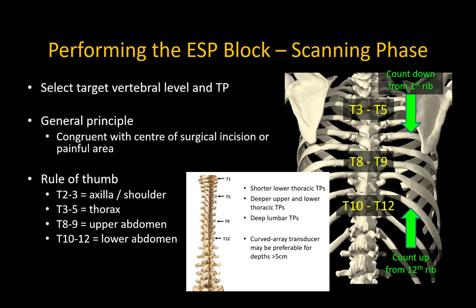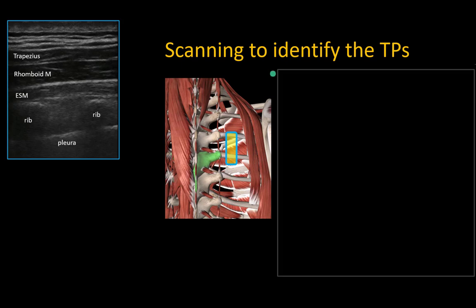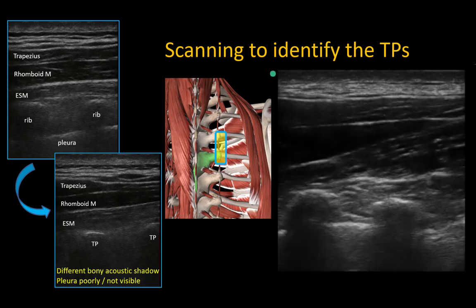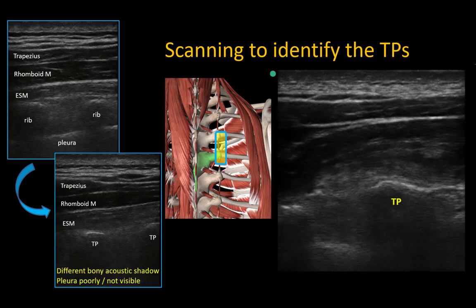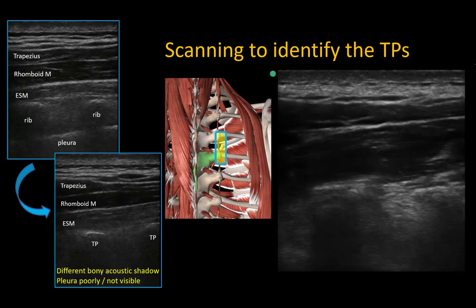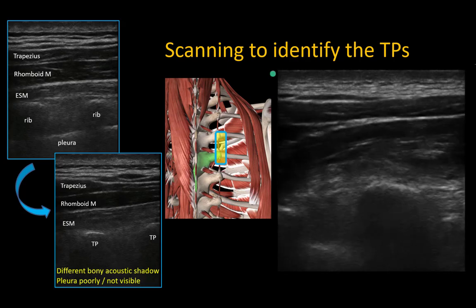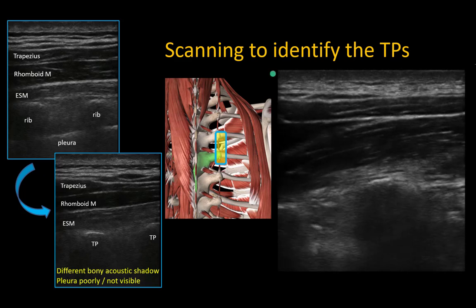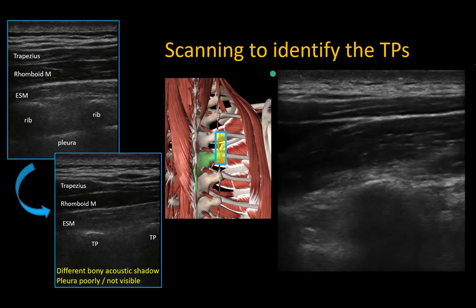Identify the target level by counting ribs. For levels from T2 to T6, I usually start by identifying the first rib and counting downwards. For low thoracic levels, I may instead identify the 12th rib and count upwards. From this lateral longitudinal view of ribs and pleura, slide the probe slowly towards the midline, looking for the transition from rib to transverse process. This is signaled by a change in the bony contour and decreased visibility of the pleura as it curves downwards. Experiment with small sliding and tilting probe movements to optimize the visibility of the transverse processes and, most importantly, the deep fascia of the erector spinae muscle. The final optimal view should give a clear view of the fascia layer that separates the muscle and the transverse processes.